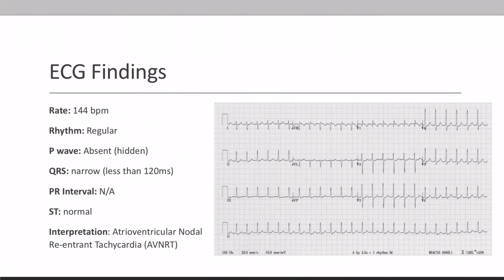Just a recap of our findings: the rate was between 140 and 150 bpm — spot on with the measured 144. The rhythm is regular. P waves are absent and are probably just hidden — we'll come back to this later. The QRS complex is narrow, less than 120 milliseconds. There is no PR interval, and the ST segment was normal. Our interpretation of this strip is atrioventricular nodal reentrant tachycardia, or AVNRT.